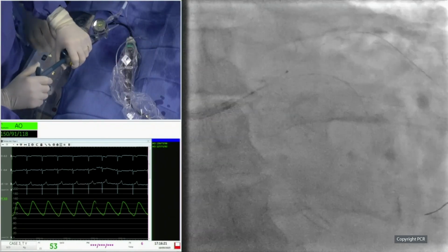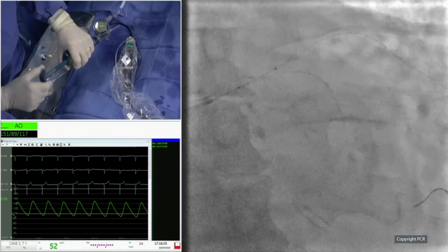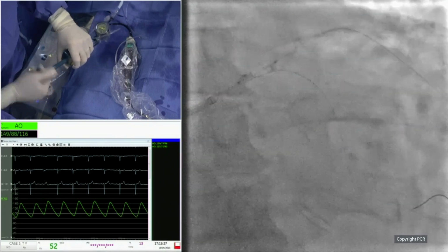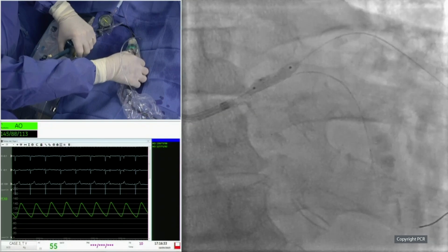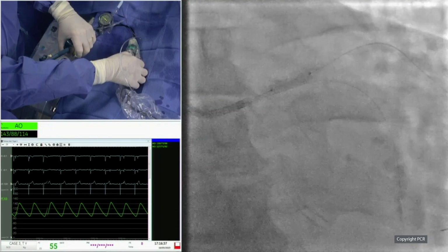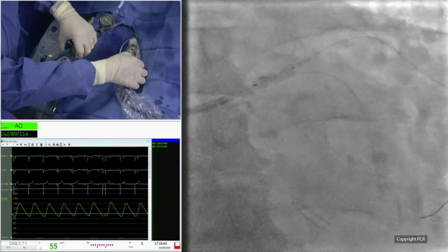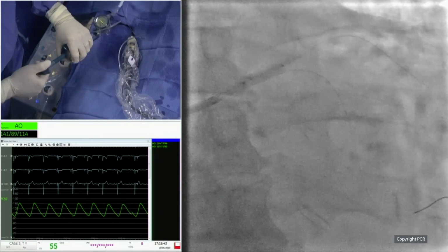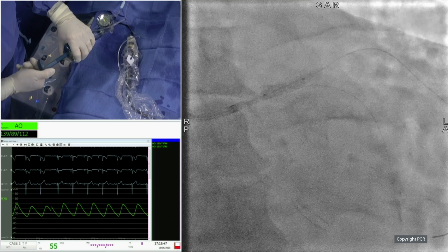We'll see, because sometimes we could have some movement of the calcium when we inflate the shockwave balloon. Especially when there is a big amount of calcium. There is still indentation. The tolerance of the patient is quite amazing, and there is even some adaptation. The blood pressure is now higher than during the first, the second, and the third inflation.